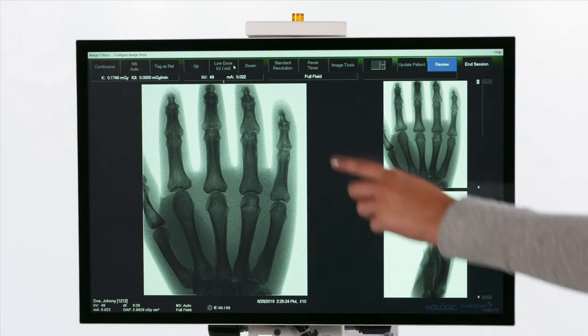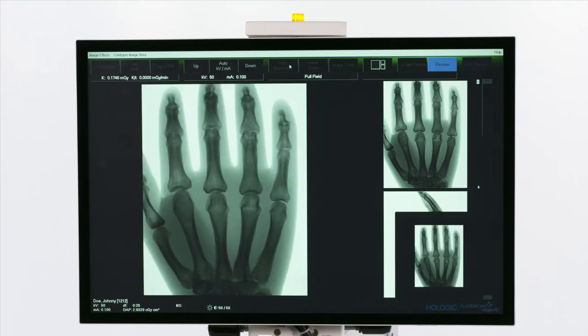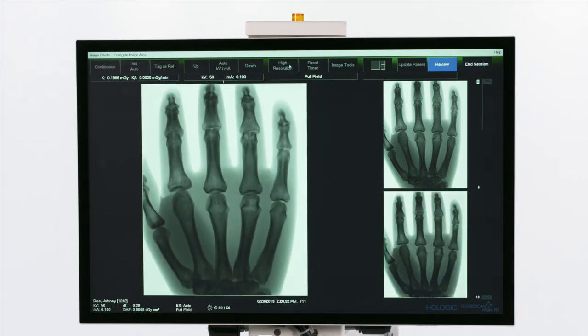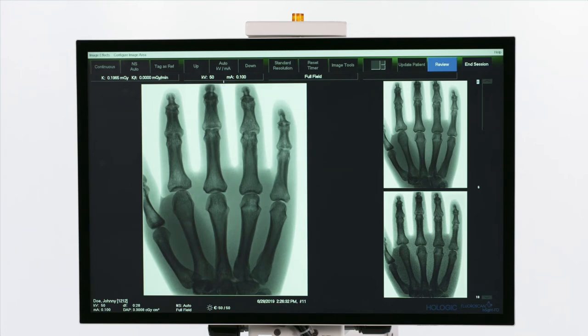Choose between standard and high resolution by clicking the Resolution button at the top of the screen. High resolution provides an option to use all pixels in the detector.